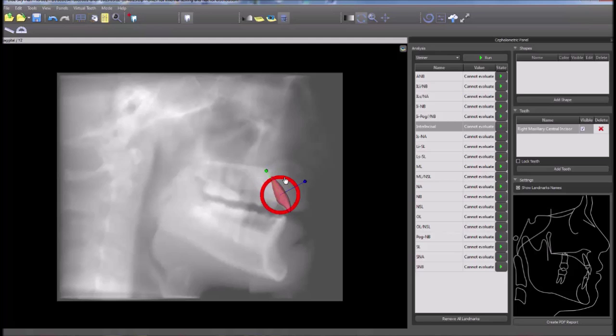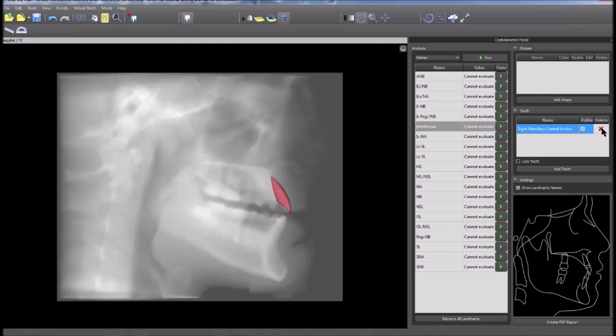In the tooth panel on the right side of the screen, the tooth can be toggled on or off by clicking the visible checkbox. A tooth can be deleted by clicking on the red x.